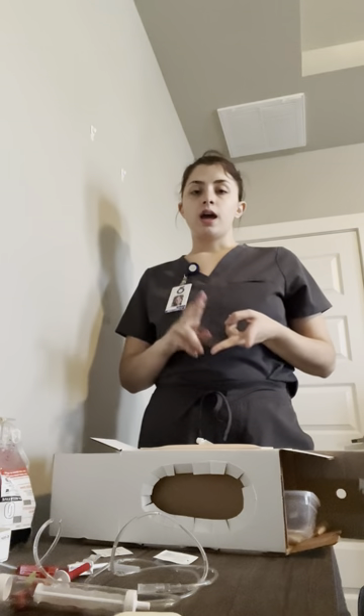I'm going to get a second nurse to identify on the blood bag that there is the client's correct name, identification number, blood type, RH factor, blood donor identification number, and expiration date.